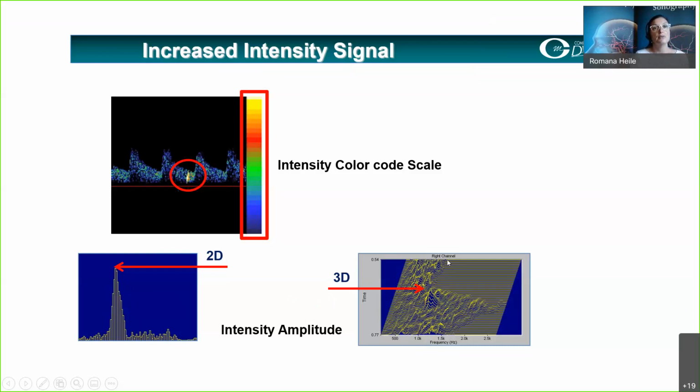So looking here, you will see a cardiac cycle. Here is the end diastolic, and then here you will see the systolic upstroke. Here would be the systolic peak, and then here again the end diastolic relaxation line. So this is supposed to be a cardiac cycle. And then you see here the intensity amplitude of the blood cells, and they are looking like little smooth hills.